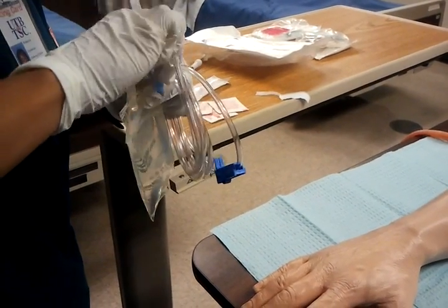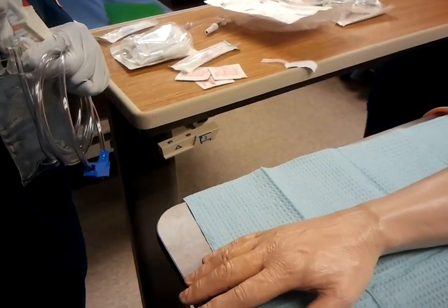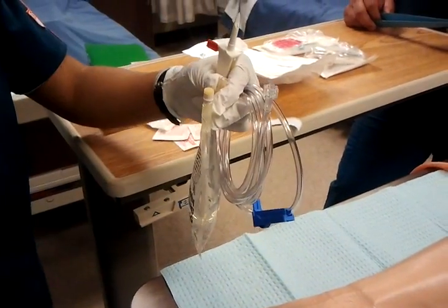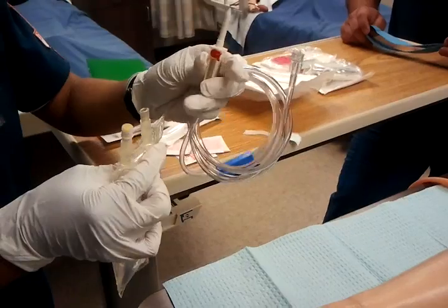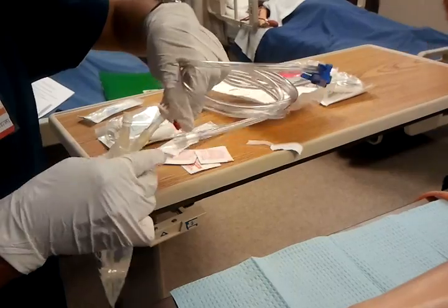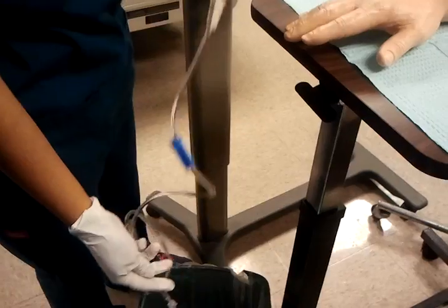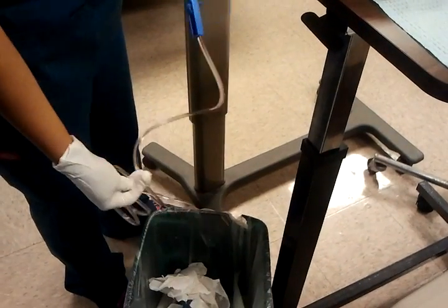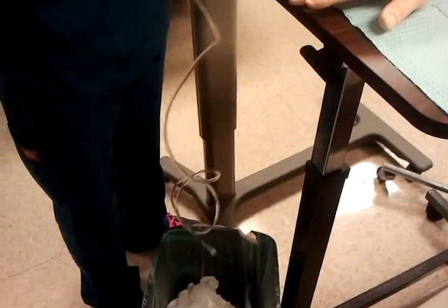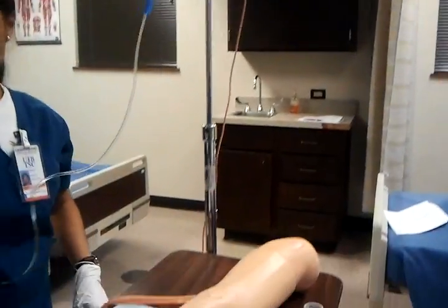We're going to prime the tubing, maintaining sterility. Priming the line and making sure there are no bubbles, we need to provide explanation to the client.